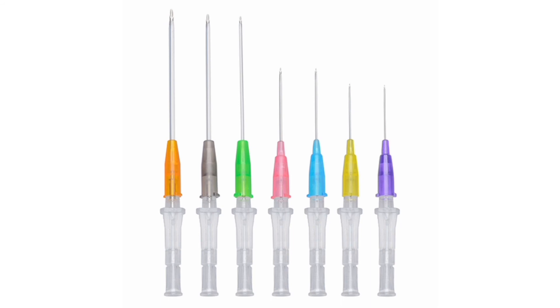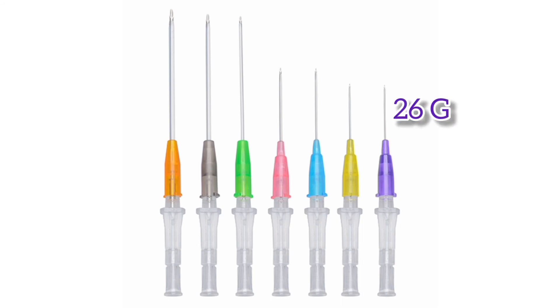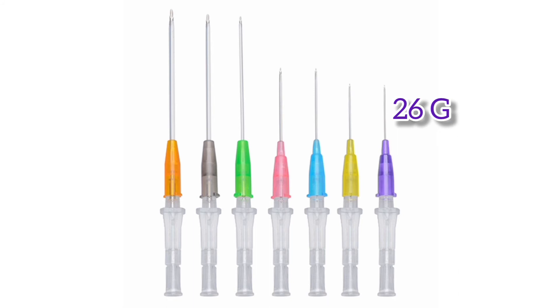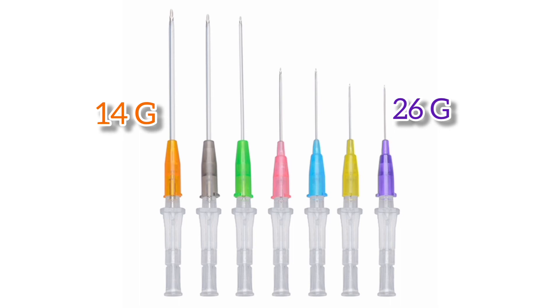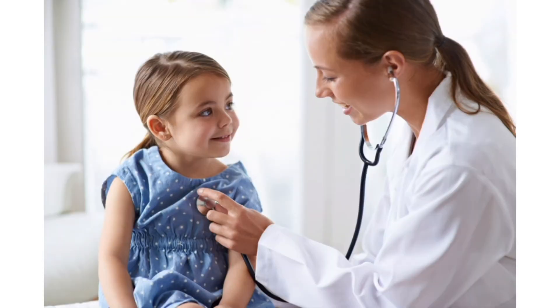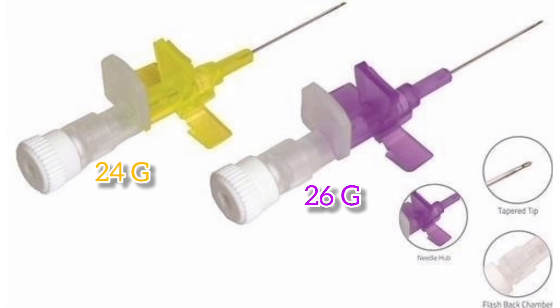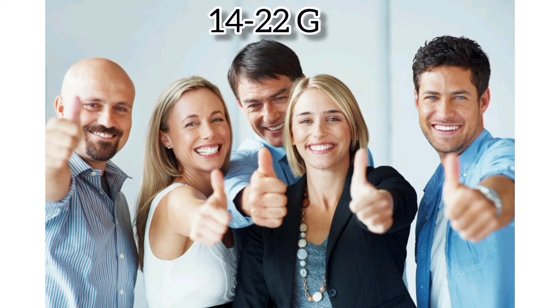The highest gauge cannula is 26 gauge, the purple colored cannula. The lowest gauge is 14 gauge, the orange colored cannula. Cannulas used for the pediatric age group are 24 to 26: 24 yellow and 26 purple. For adults, we use 14 to 22 gauge cannulas.